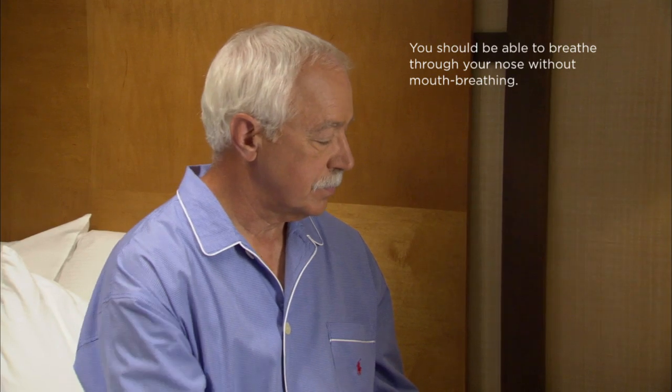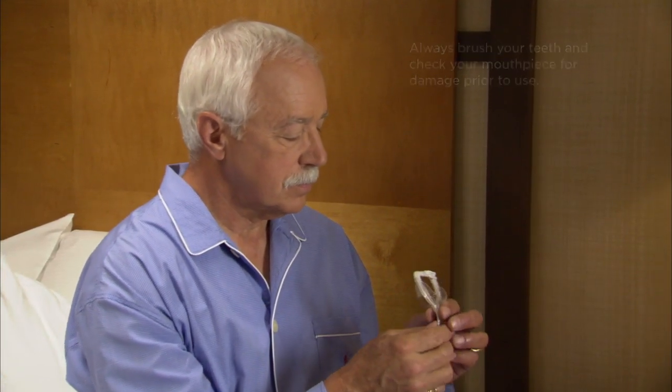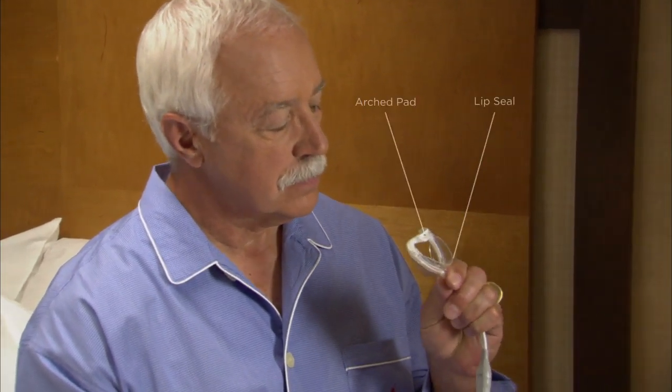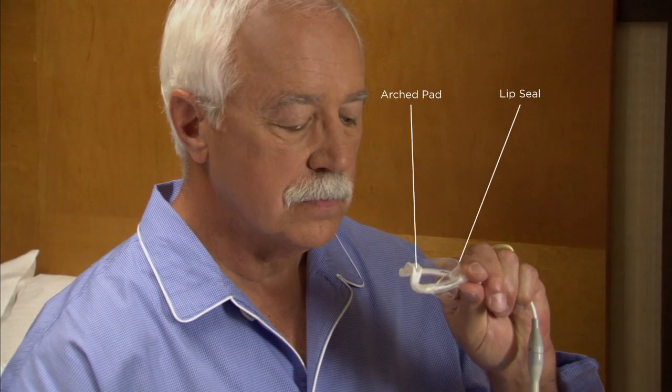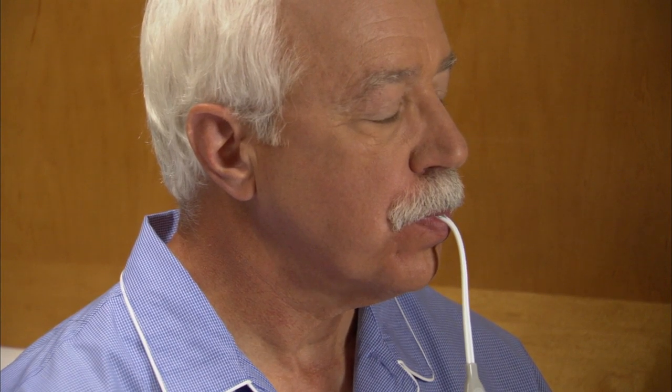Insert your mouthpiece while sitting in an upright position. Hold the mouthpiece in one hand with the arched pad toward the back of your mouth and the lip seal facing away from your mouth. Make sure the arched pad is facing up toward the roof of your mouth. Place the mouthpiece in your mouth so that the lip seal sits between your teeth and lips, and begin breathing through your nose.